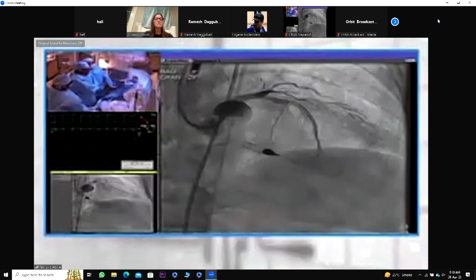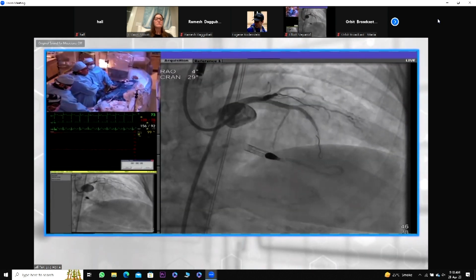Yeah, it's a wonderful result, and the patient is well controlled on this Impella, maintaining the blood pressures and everything. And obviously, this kidney function needs to be followed, as you say. So it was a wonderful session with you, except for the initial hiccups. Otherwise, the whole case went very well after that.